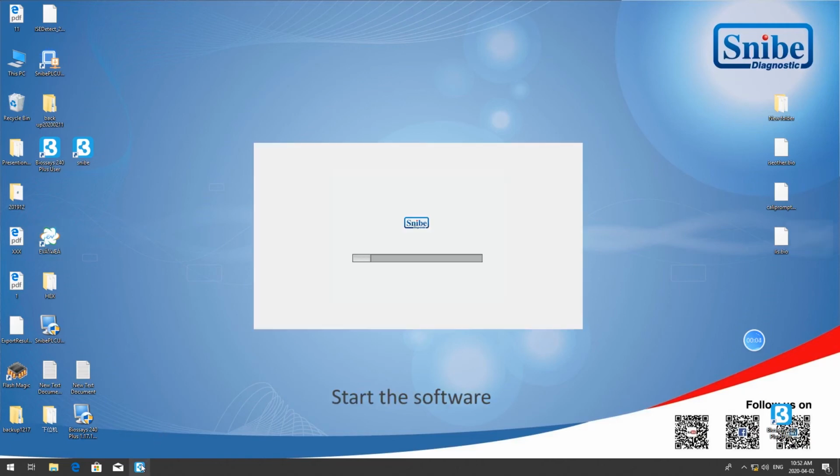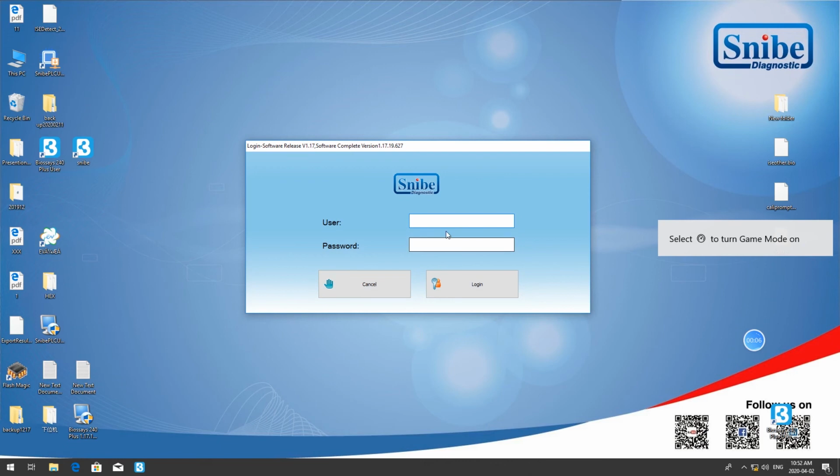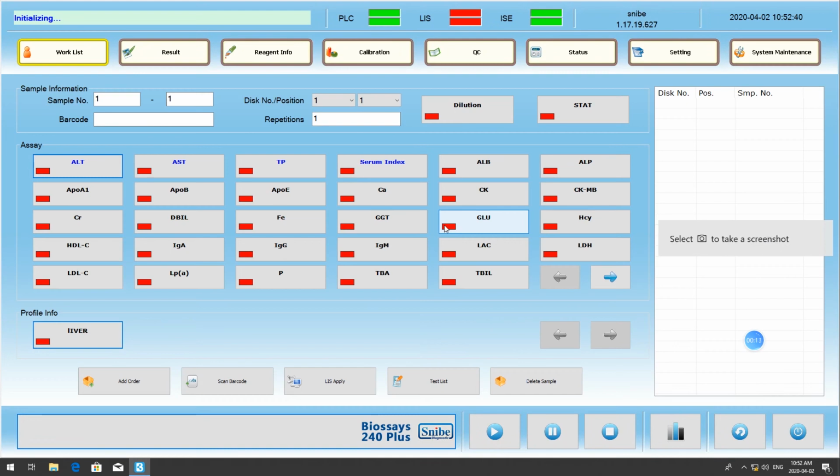Start the software. The instrument is initializing.